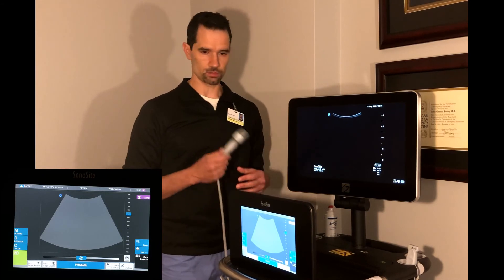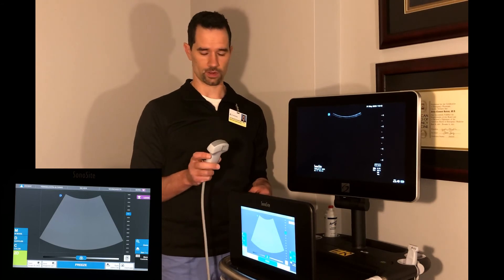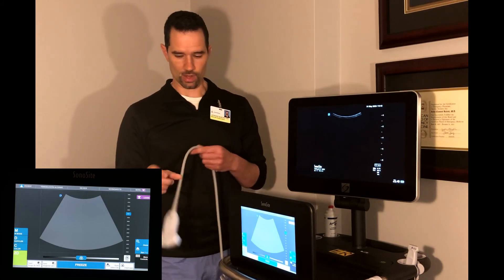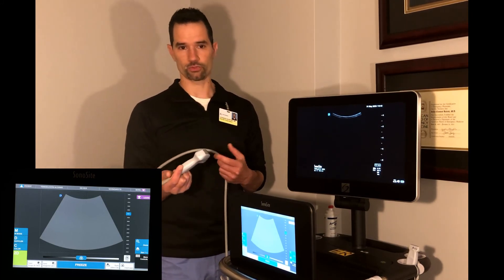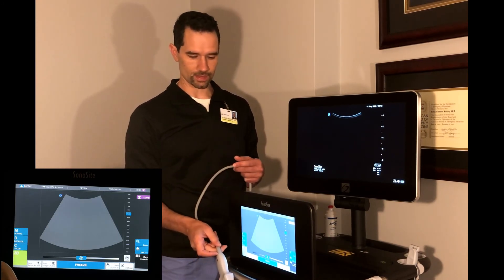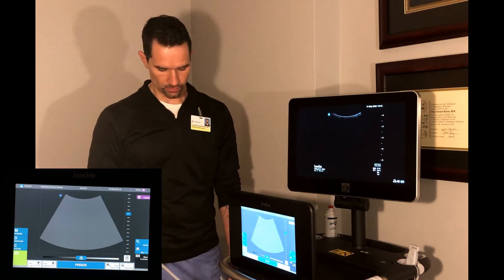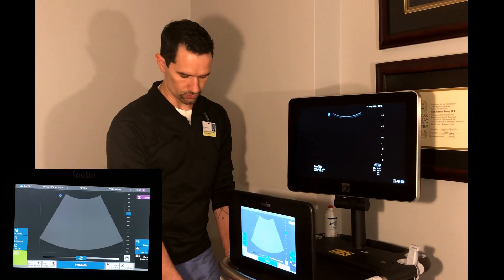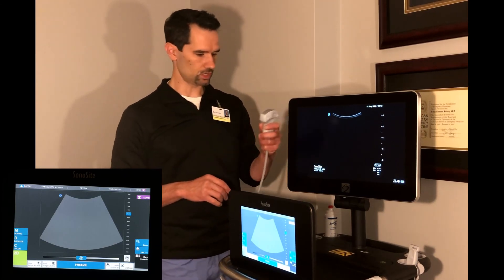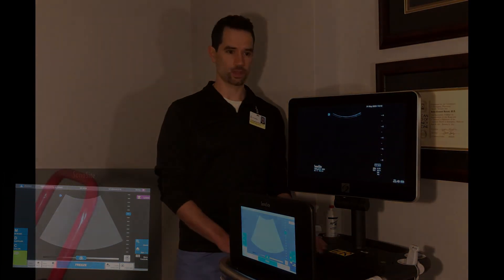The probes themselves are pretty robust. Sonosite is very well known for how strong their probes are. Just be cautious — if they drop straight down on the ground head first, they almost always will break. If they bang lightly on the side, they're usually fine. The main thing is to protect the cord; the holsters are there so the cord never has enough length to drop all the way to the ground, which damages the crystal. Generally, keep them in your hand or in one of the holsters. Thank you and enjoy scanning.